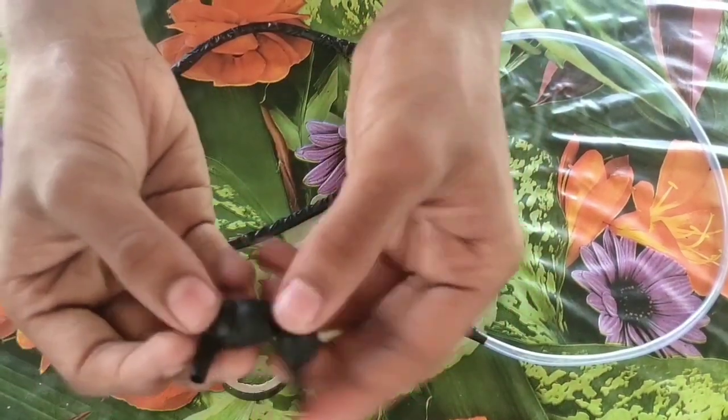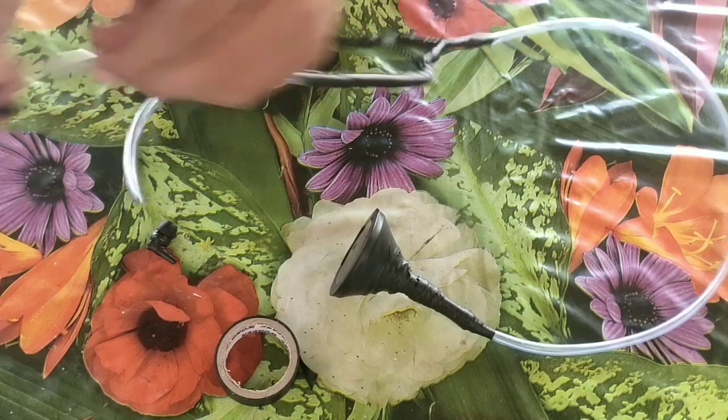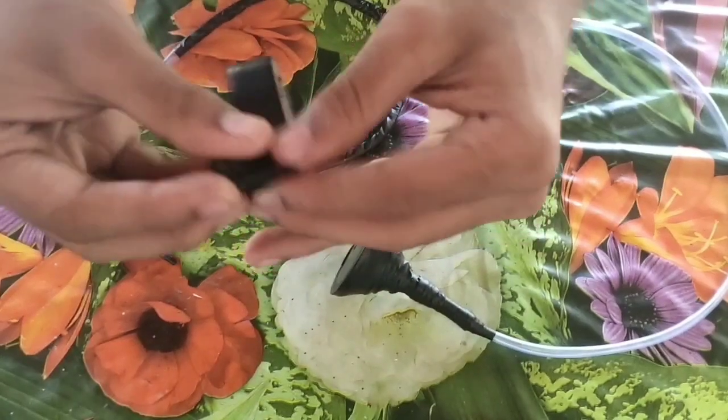This is the last part of the plastic tube. It is used to connect the plastic tube.